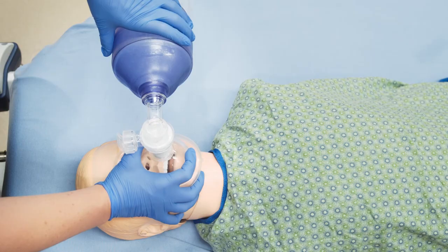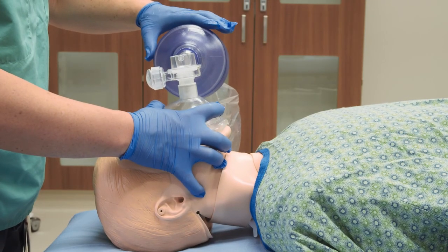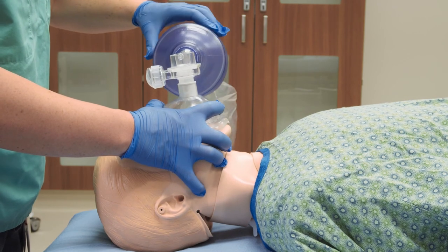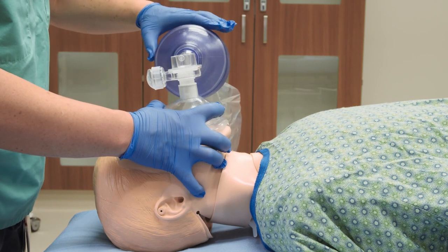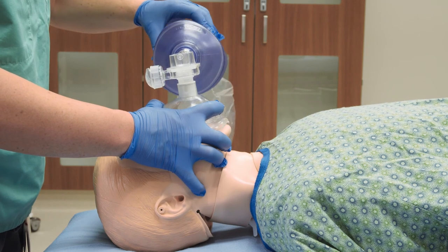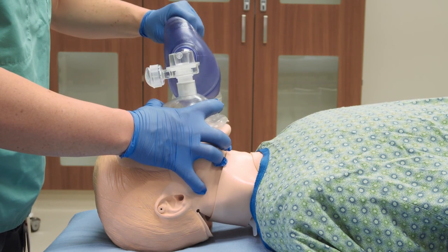Watch the chest rising and falling evenly with each breath. If the patient is breathing on his or her own, deliver breaths when the patient takes a breath during inspiration. Do not attempt to deliver a breath as the patient exhales. Give one breath every six seconds, a rate of 10 breaths per minute in an adult.